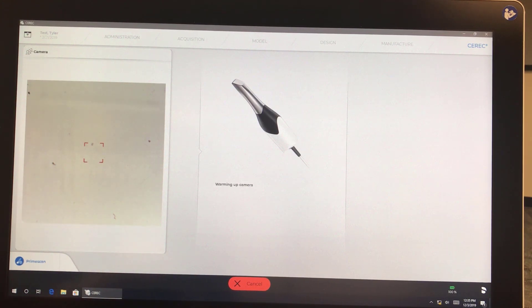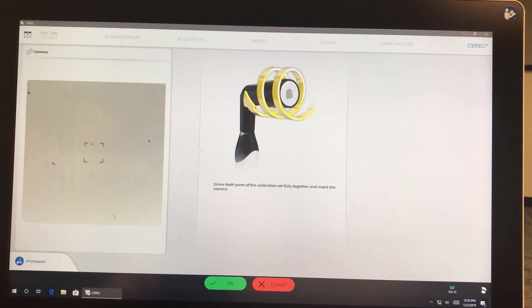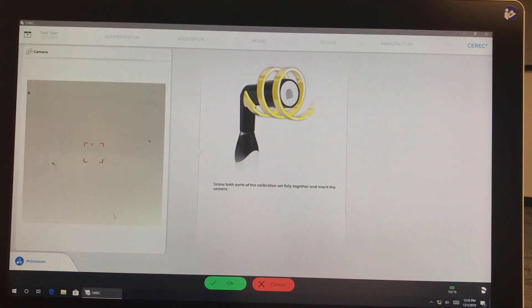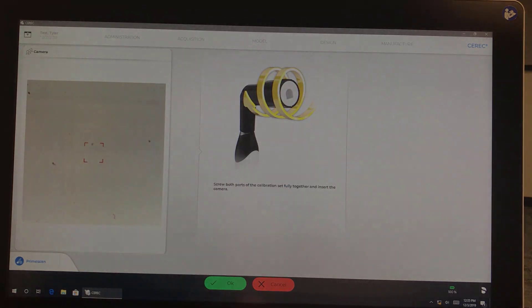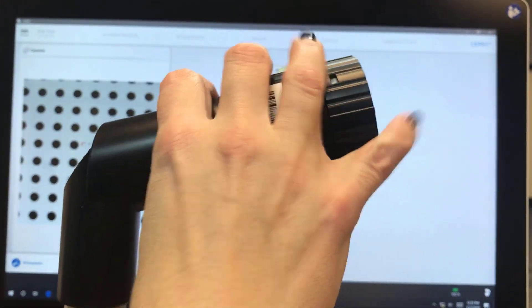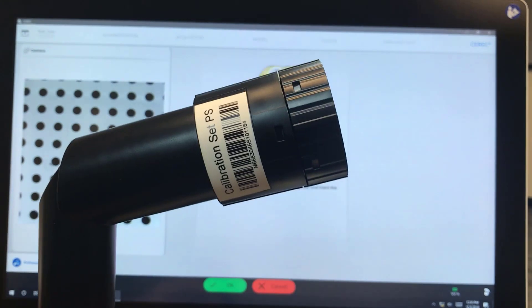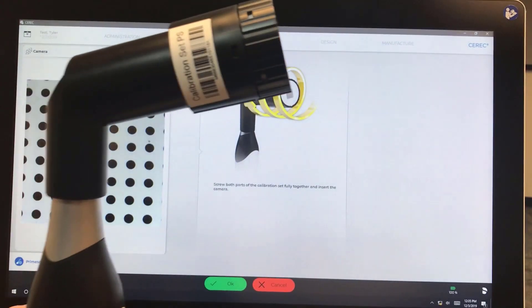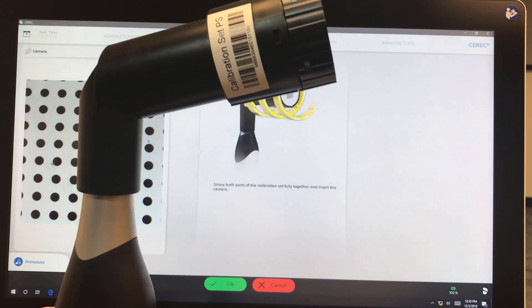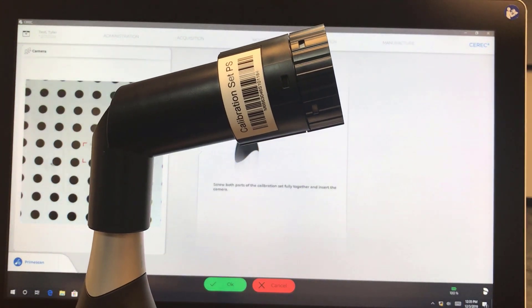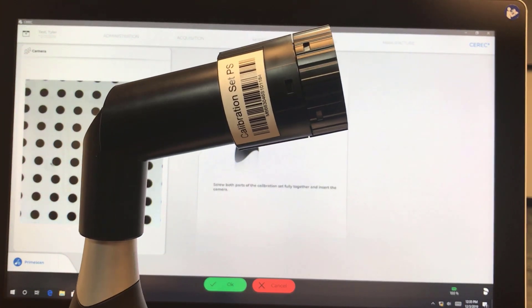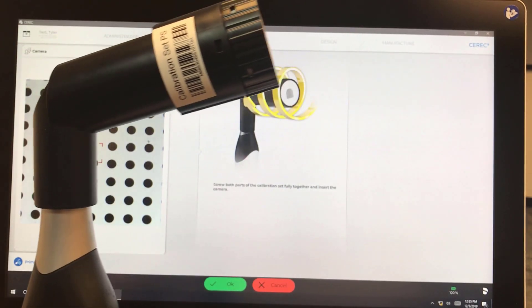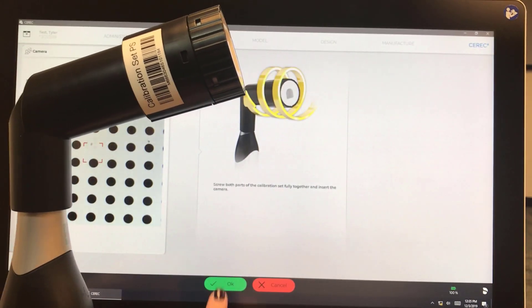So we let the camera warm up in here. And now it's just telling us to make sure that the bottom is screwed in all the way. And we're going to mount the calibration tool just as it shows us in the picture. Make sure that as we're calibrating, we're holding the camera upright. We're going to hit OK.